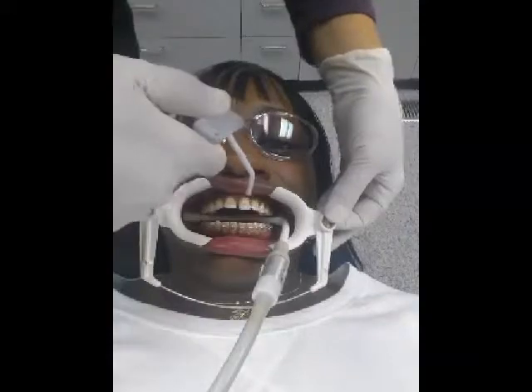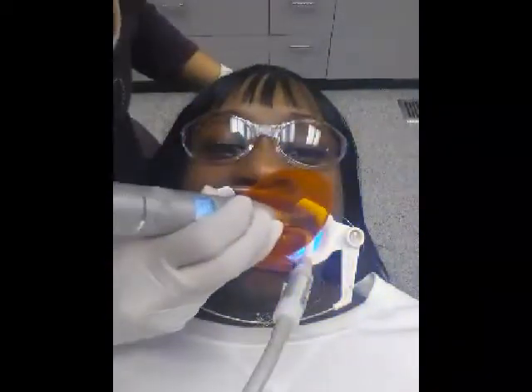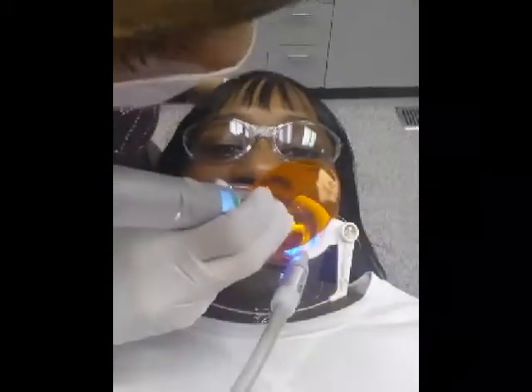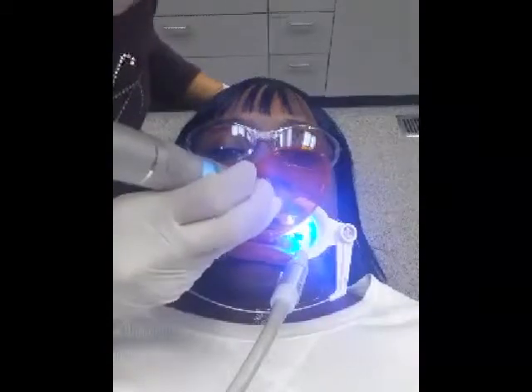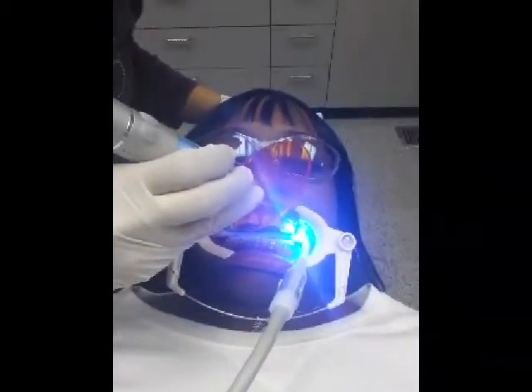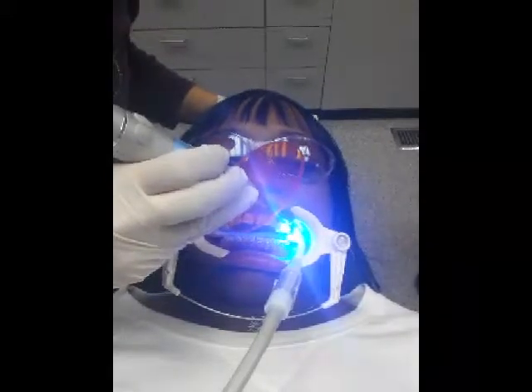And then after they do the placement of the brackets, she pretty much just takes, I think they're almost looking like little tweezers or plier looking appliances, and they just take off the little color coding. But after she places the primer on it, she takes that light and she dries the primer before placing each bracket.